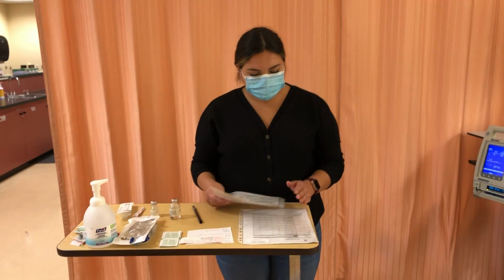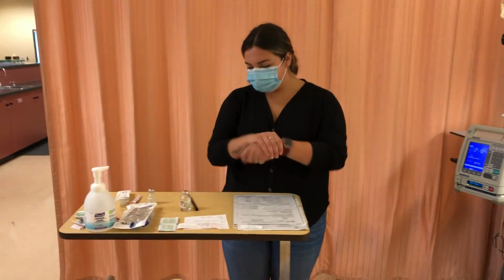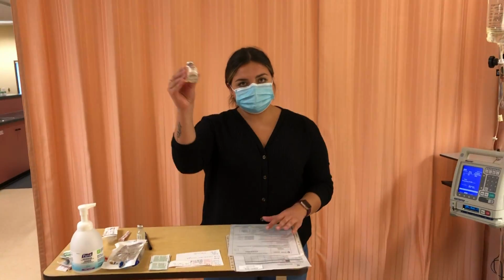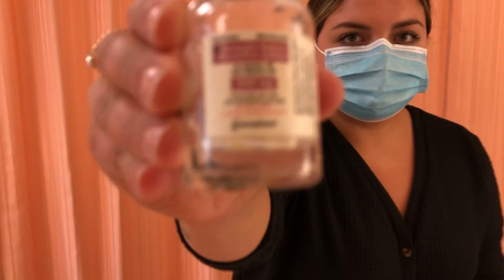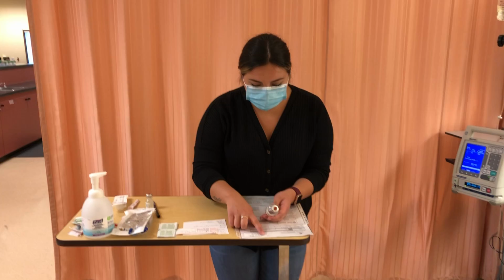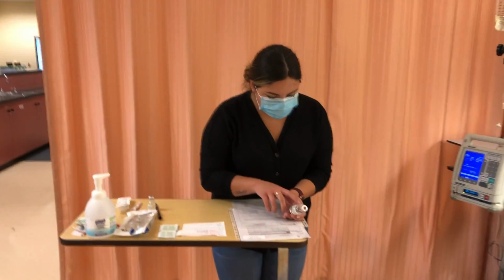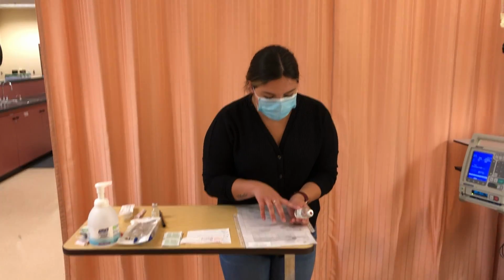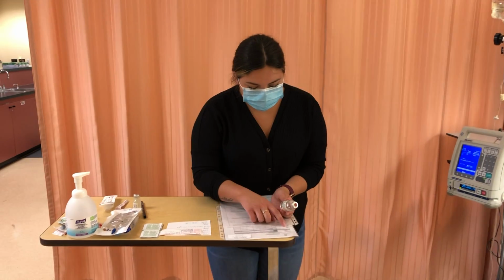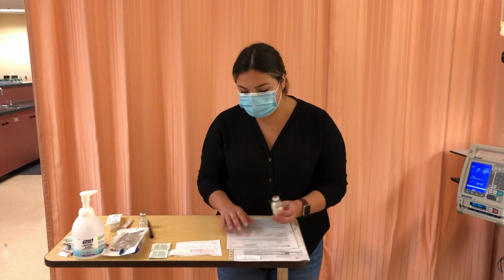To prep the medication, I'm going to do hand hygiene. And she's been prescribed cloxacillin, so I've selected cloxacillin. So doing my first check, I have Emma Wrightson. She's been given cloxacillin, 1 gram. This is a 2 gram vial, so I'm only going to need half. It is to be given IV. This is for IV use only. It is due every 6 hours, and the next dose is due now, so I'm good to prepare this medication.